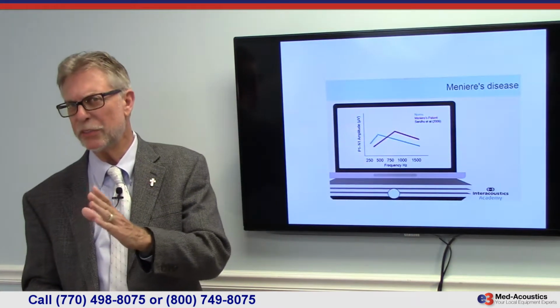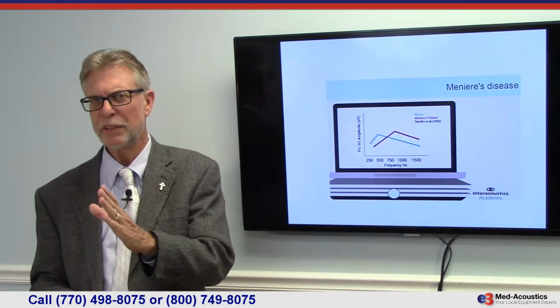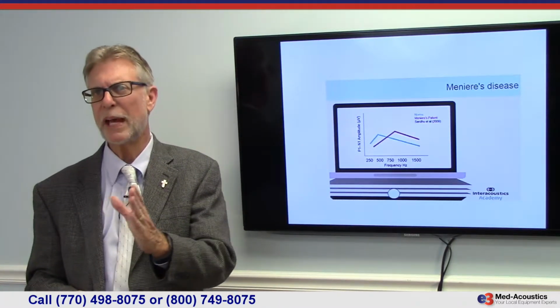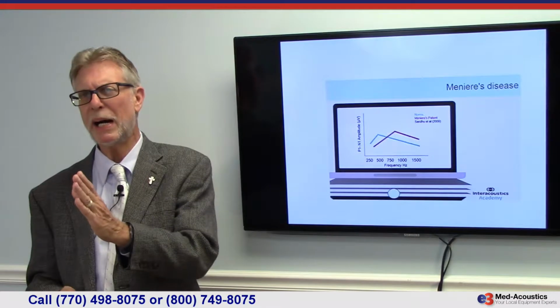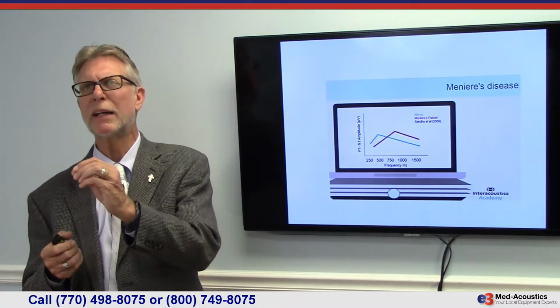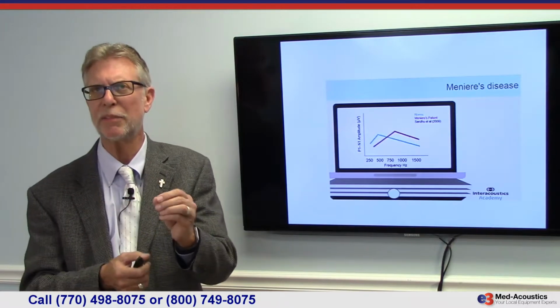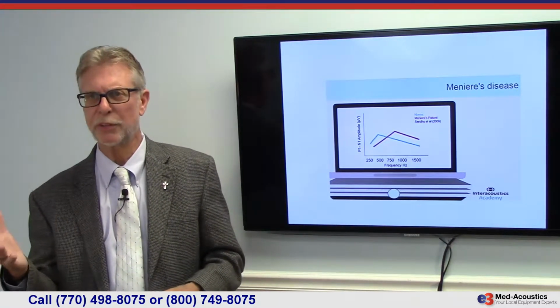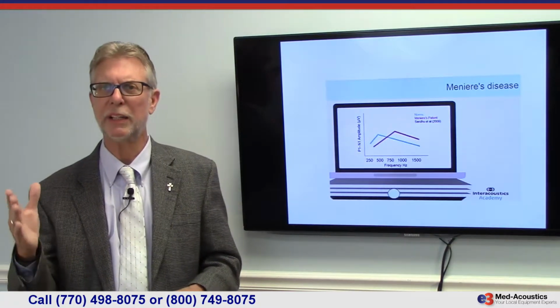But with Meniere's, it's shown to shift. It's like the fundamental frequency response shifts so that the peak response, the highest amplitude response, now occurs around 1,000 hertz instead of 500 hertz. So another indicator of Meniere's would be a shift in frequencies.